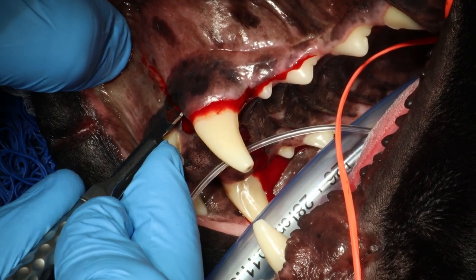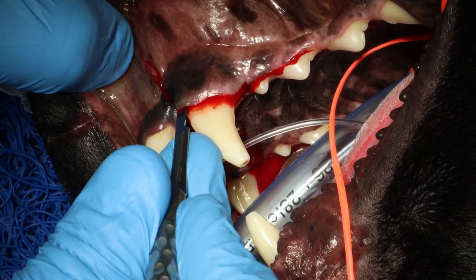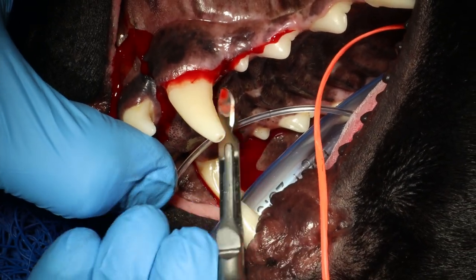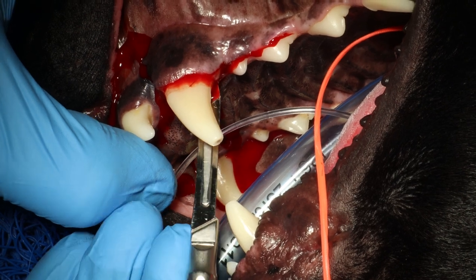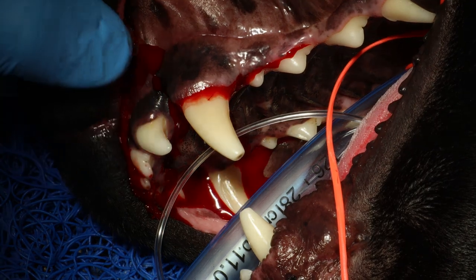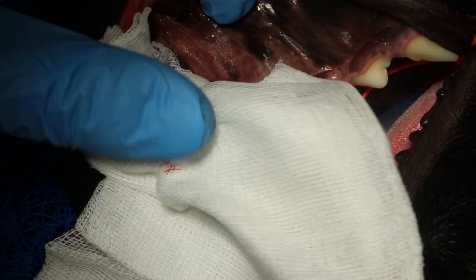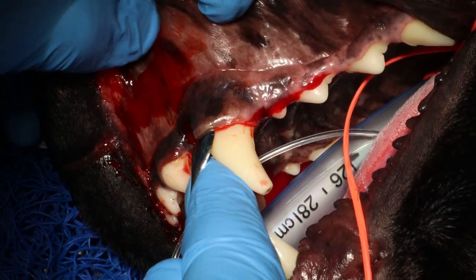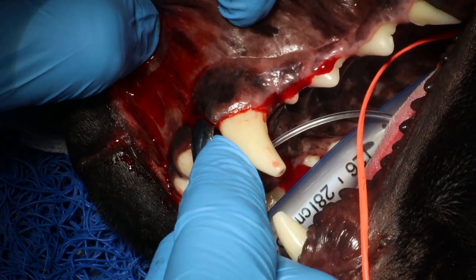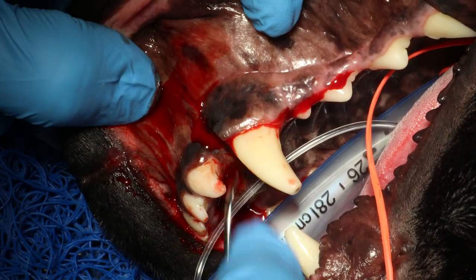You can see I'm going past the mucogingival line into the mucosa. You always want to cut downwards towards the teeth. Now I'm creating stab incisions on the lingual aspect as well, keeping the scalpel parallel to the tooth and adding about a 15-degree angle to make your incision into the sulcus.